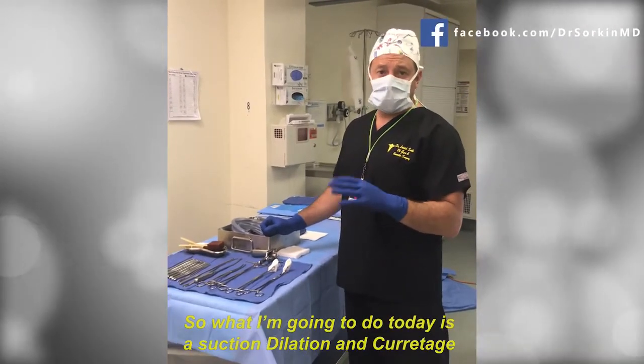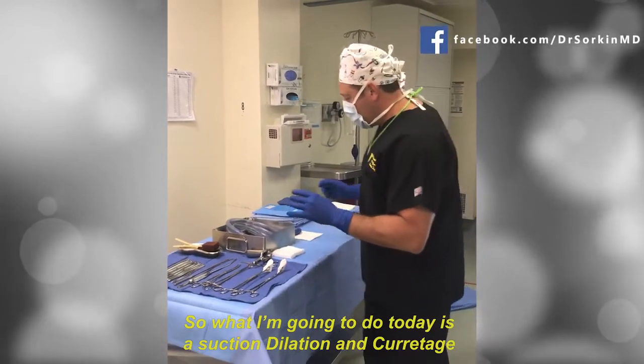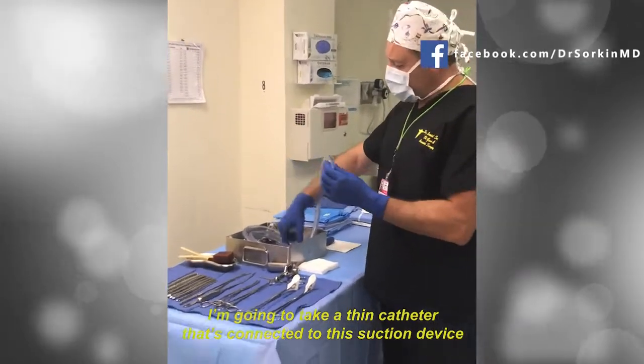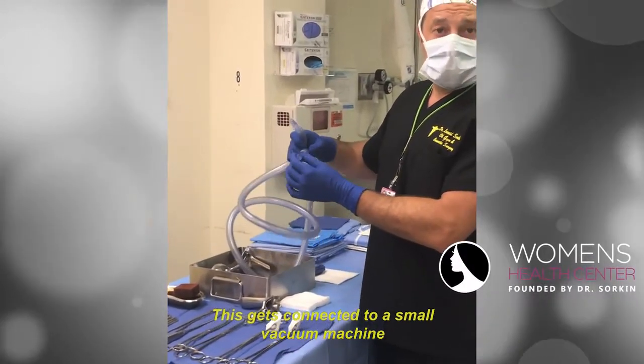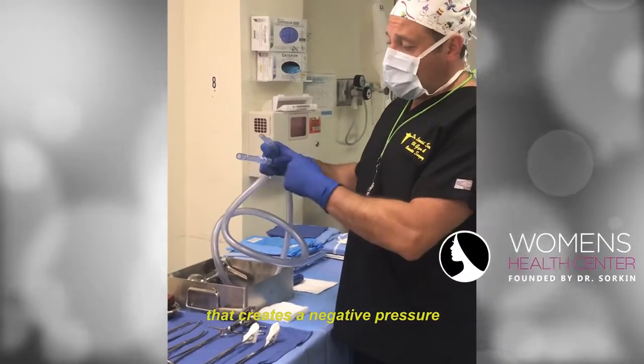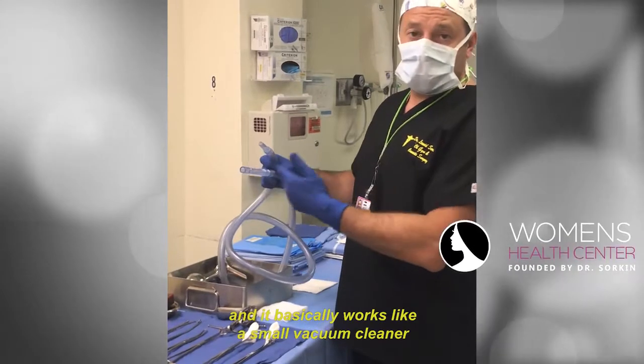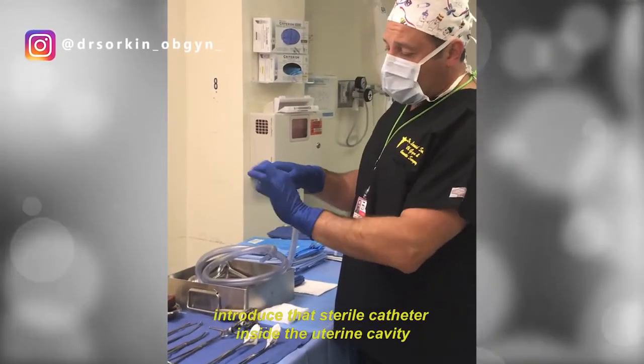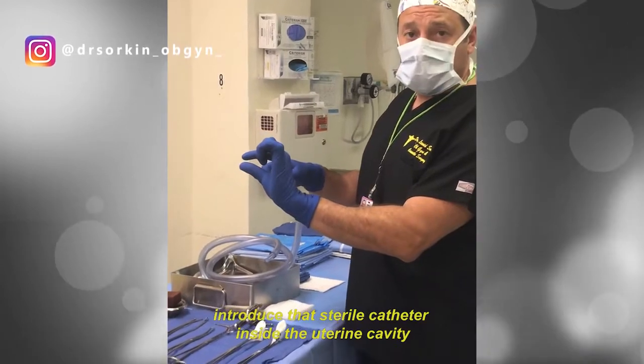What I'm going to do today is a suction dilatation and curettage. I'm going to take a thin catheter connected to a suction device, which is connected to a small vacuum machine that creates a negative pressure — it basically works like a small vacuum cleaner. I'll introduce that sterile catheter inside the uterine cavity.